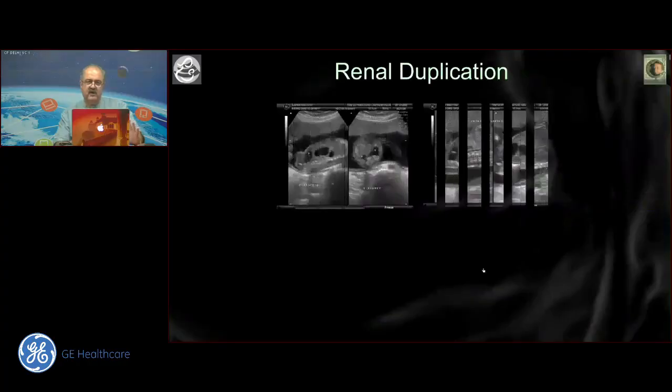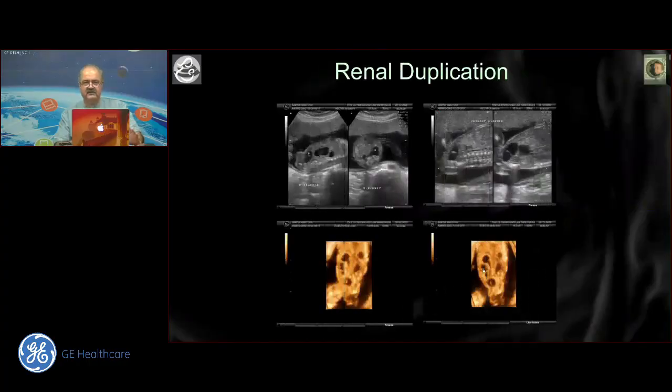When it comes to looking at cystic spaces that you're not sure of, like in this particular one, cystic spaces in the renal fossa, cystic spaces below the renal fossa, cystic space in the bladder, and within the bladder another cystic space, it might become a little difficult to sort out. The best thing in that situation is to run a 3D acquisition in one of those long coronal planes in the posterior part of the fetus, and everything stands out instantly because we have inherent contrastiness without using radiological contrast in the fetus. And this is how it works.